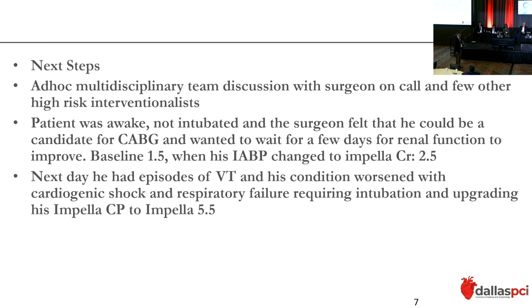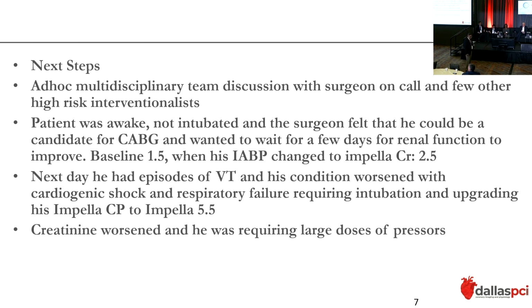Next day, the patient had a few episodes of VT and his condition worsened, cardiogenic shock worsened, and he now needed to be intubated with respiratory failure. He was doing very poorly, so the Impella CP was upgraded to Impella 5.5.